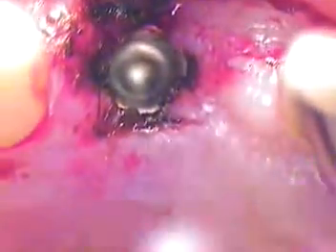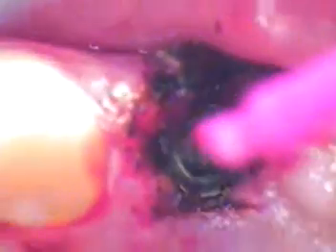Again, I've pre-soaked this with tartar and stain. I'm going to just go in and do a little rotation inside, scrubbing the inside of the fixture, controlling it. You feeling that at all? No? Okay. Anything burning at all? Okay.